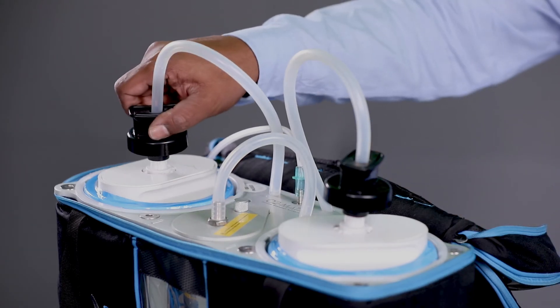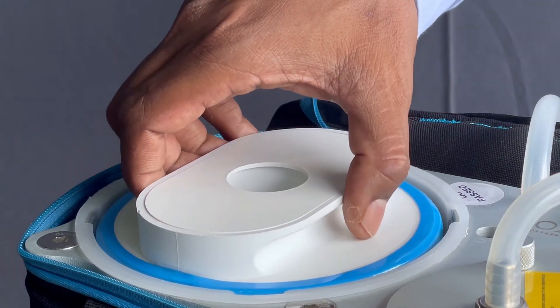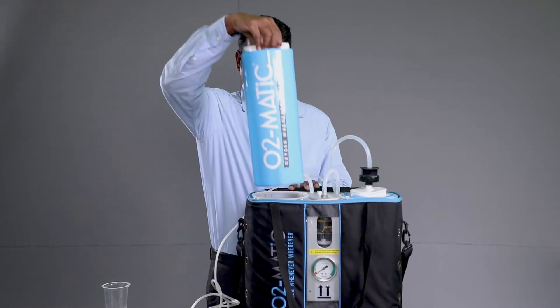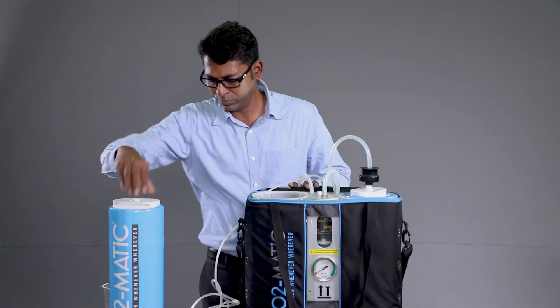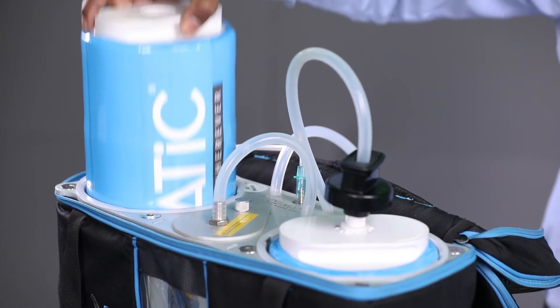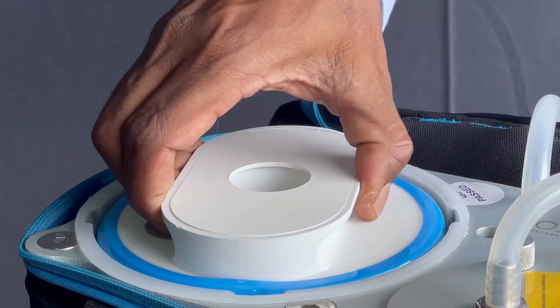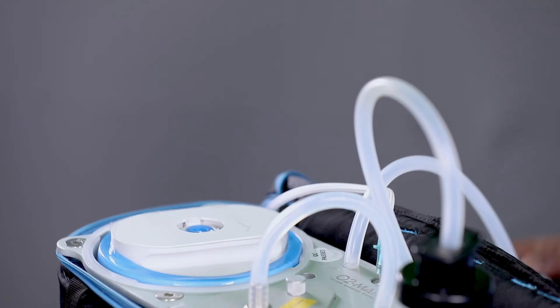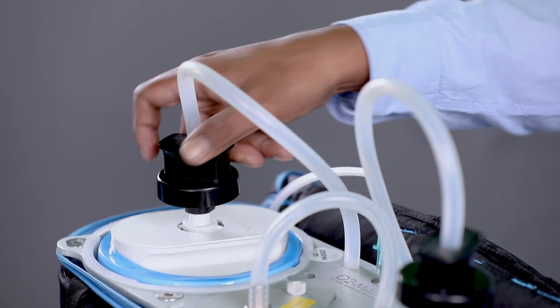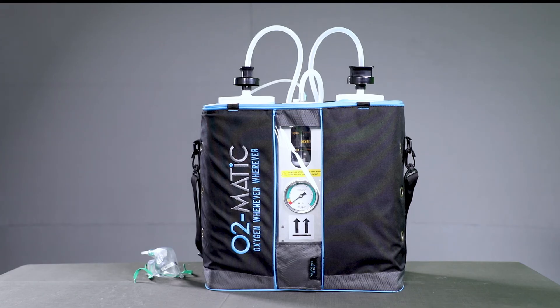Unlock the twist trigger from the depleted cartridge. Unlock the depleted cartridge by rotating it anticlockwise and pull out the depleted cartridge for replacement. Take a new cartridge and insert it into the empty cartridge slot and turn it clockwise to secure the replacement cartridge onto the main kit. Position and lock the corresponding twist trigger into the replaced cartridge. The replaced cartridge is ready to be triggered if required. Follow the same steps to replace the second cartridge when the second cartridge is depleted.